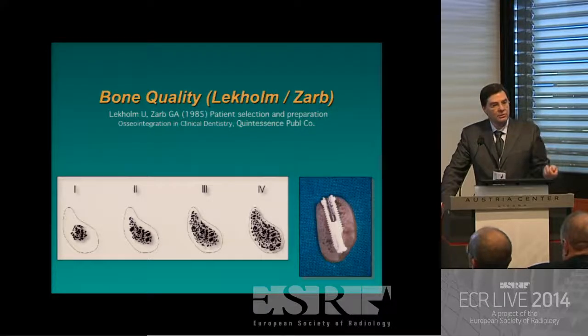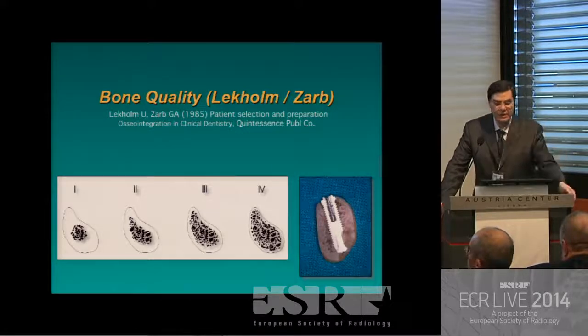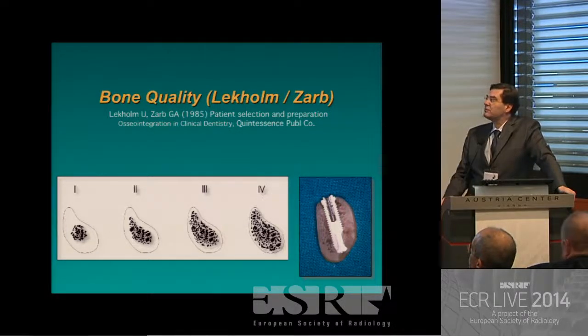When you drill the bone and put the implant inside, the implant will still be moving. If you put on a little force, you have to put it inside and leave it there for a very long time so it grows in, and hope that the atrophy doesn't continue after the implant placement and the time of waiting that it grows in before you put the superstructure on the implant.